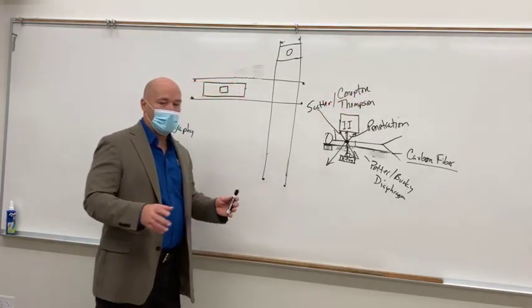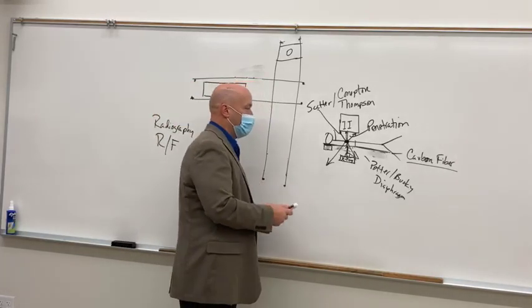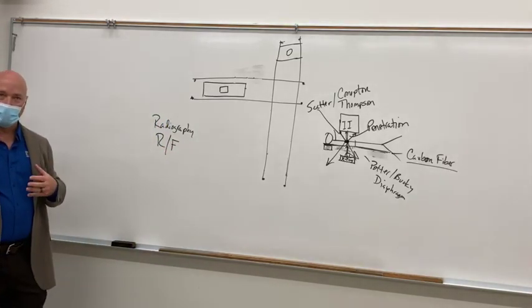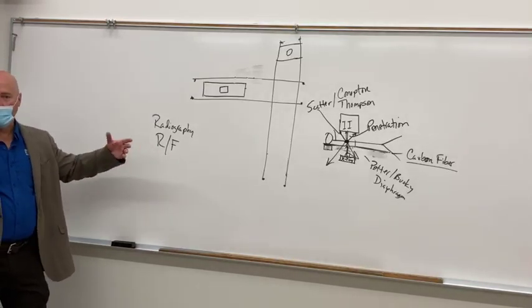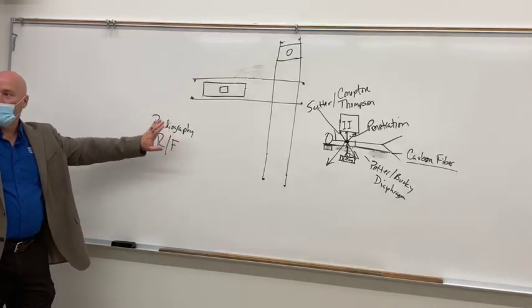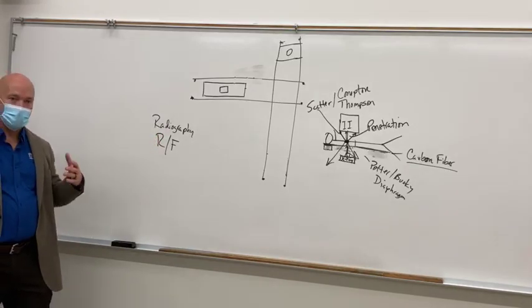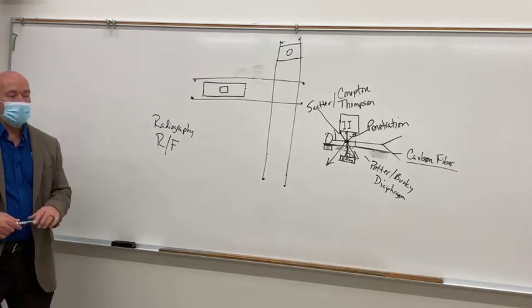And I went all that way to describe this function of your table. You're in a room that does fluoroscopy, and most of your general diagnostic rooms are going to be RF rooms. You've probably got some ER rooms that are just radiography, but I don't know that I've ever worked with a room that is strictly fluoroscopy that wasn't a specialty room, like special procedures or something like that. So most of your rooms are going to be RF rooms.